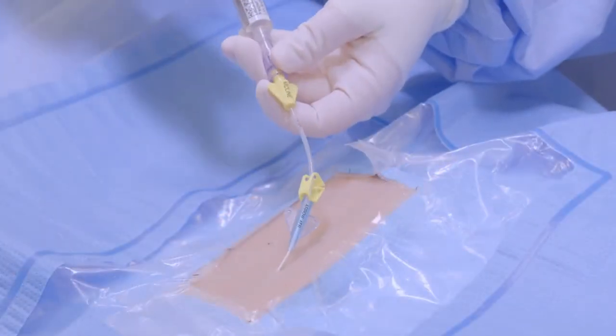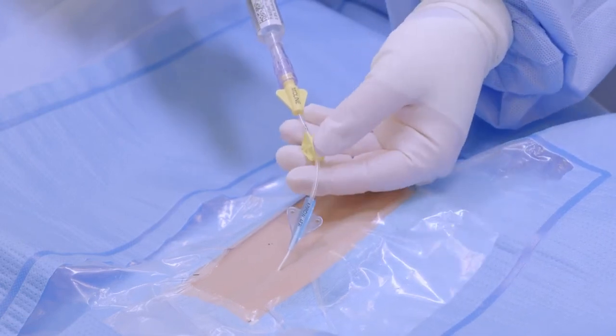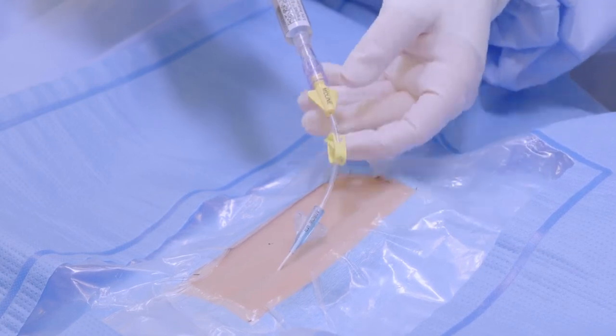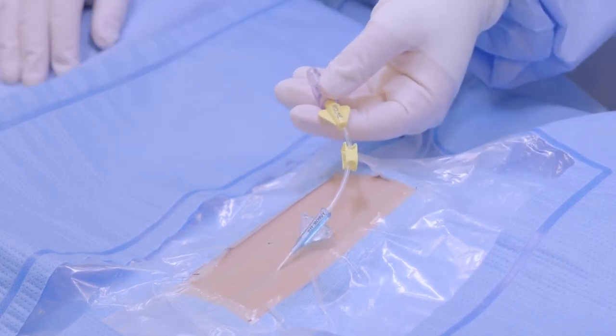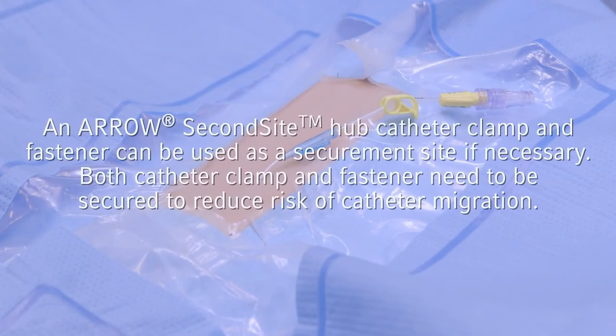To complete the procedure, attach a syringe filled with sterile, normal saline for injection to the catheter hub. Aspirate to assess for free-flowing blood return, and then flush the catheter using a pulsatile technique to clear the catheter lumen. When applicable, a second site hub catheter clamp and fastener can be used as a securement site if necessary. Both catheter clamp and fastener need to be secured to reduce risk of catheter migration.